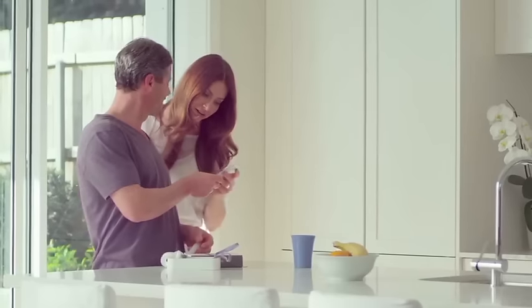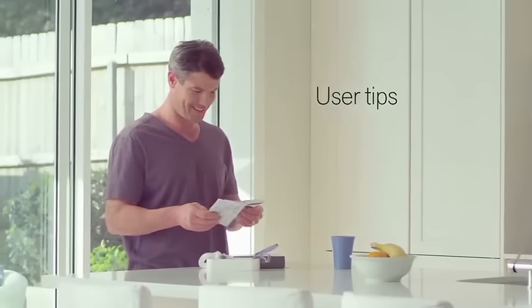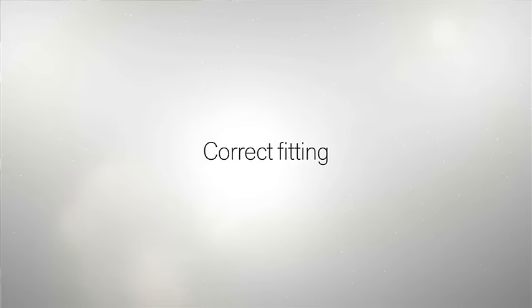Congratulations on choosing the AirFit P10 Nasal Pillows Mask — a quieter mask to fit your sleep. Here are some handy user tips to help you get the most out of it.